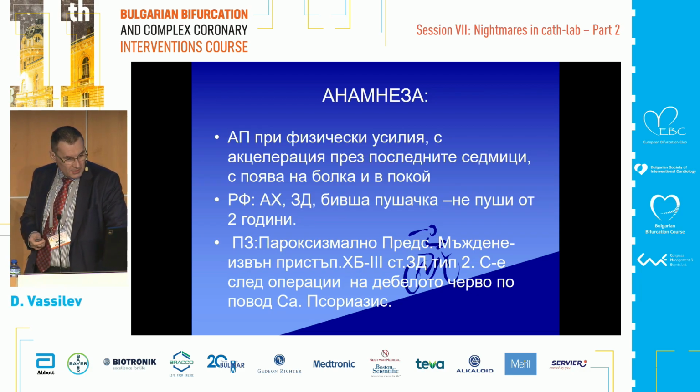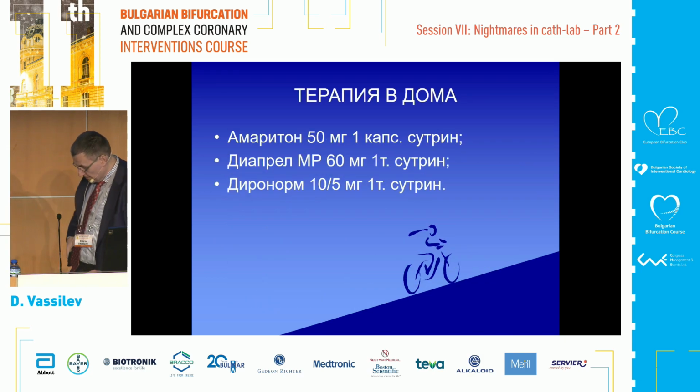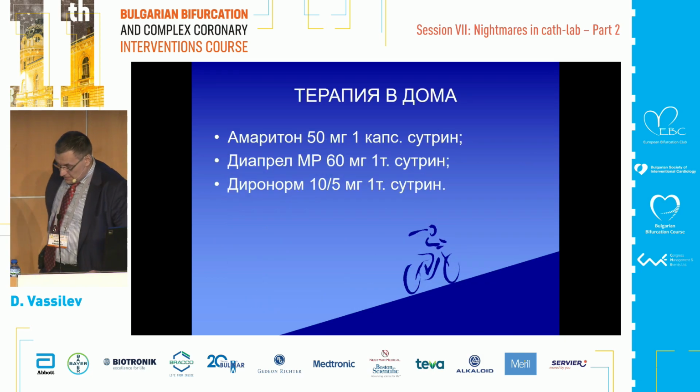This is a 71-year-old female patient with stable angina with acceleration and atrial fibrillation, operated on for colon cancer.